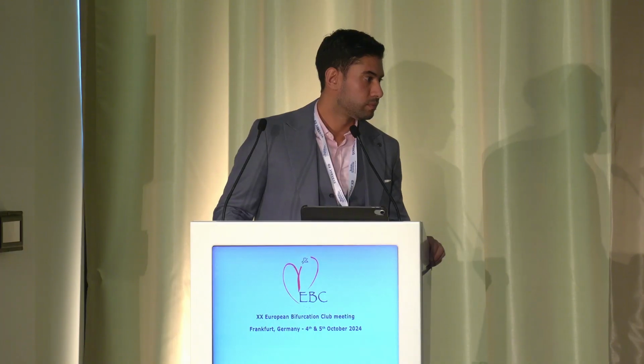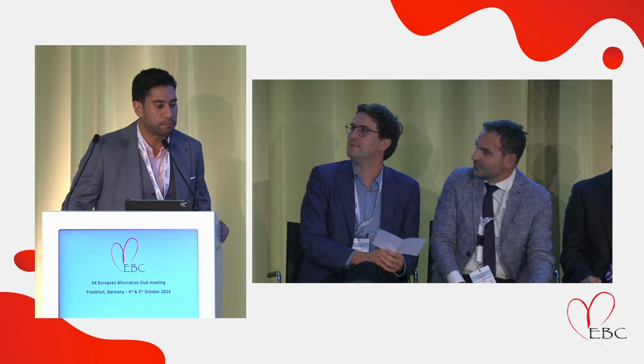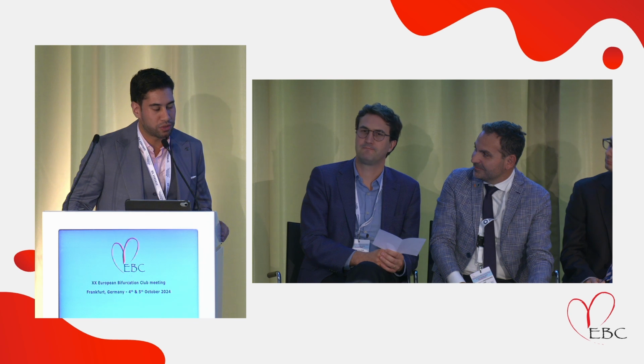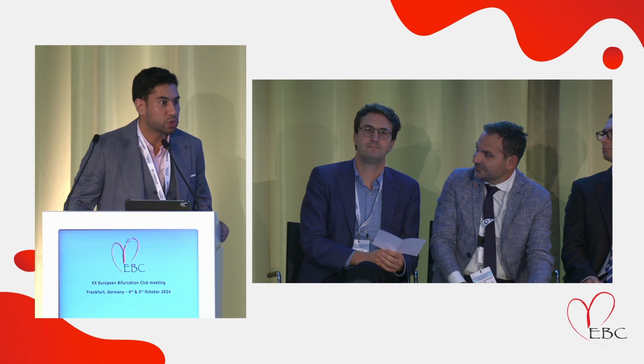So, what is your final recommendation when you have a trifurcation? Still, we cannot conclude any recommendation from that. Still, I mean, your experience, in vitro experience. I have to agree that, personally speaking, I don't have much experience in terms of trifurcation treatment, but from experienced operators, we should aim for one stent as much as possible. That would be the aim, but not all anatomies would be suitable for that. So whenever we can end up with one stent, that would be the first strategy. So we go with the provisional. And if we cannot end up with one stent, then we go for 2 or 3 stents?